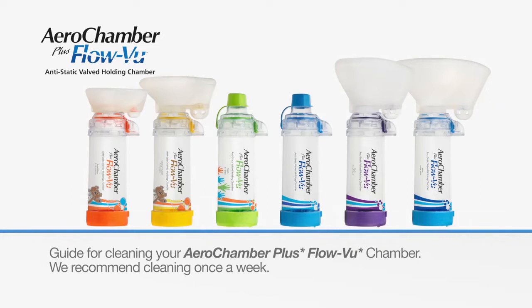The AeroChamber Plus FlowView Chamber can be used right out of the package, after which we recommend cleaning once a week.